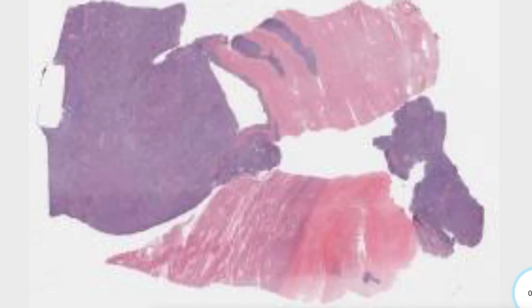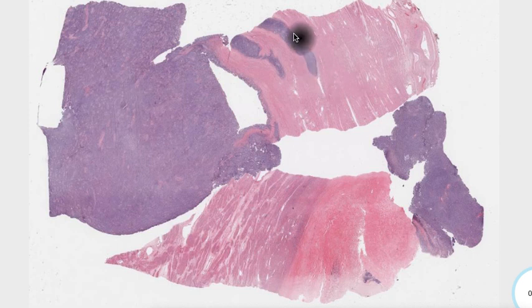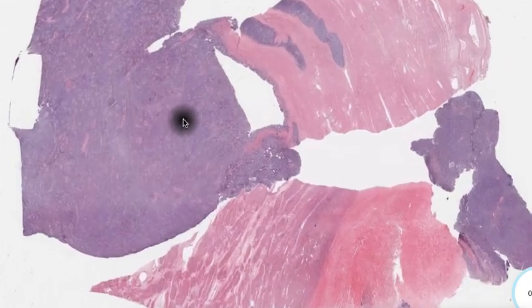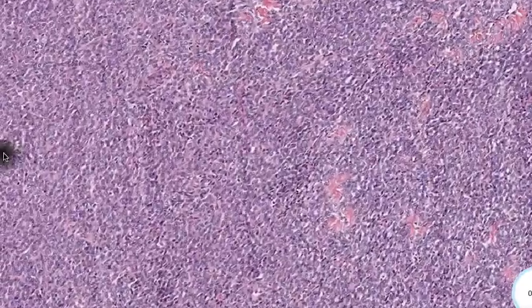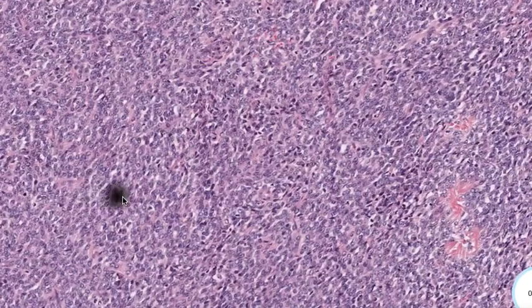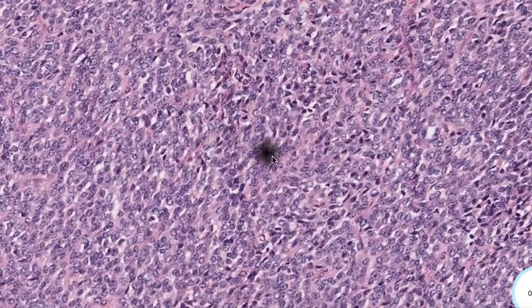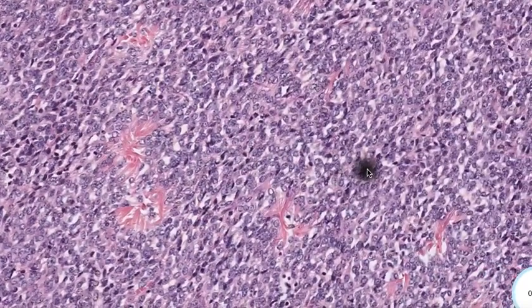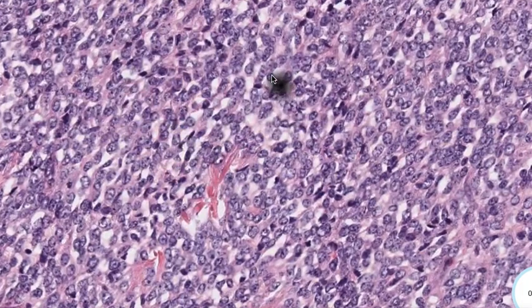One more slide showing this infiltrative pattern of the tumor, this one coming closer to the endometrial surface. Again, this is a tumor of fairly uniform spindle-shaped cells, with a delicate vascular background and occasional mitoses. There's a little bit more coarse nuclear chromatin in this particular field and a little bit of atypia, but nothing very high-grade and no wildly pleomorphic nuclei.